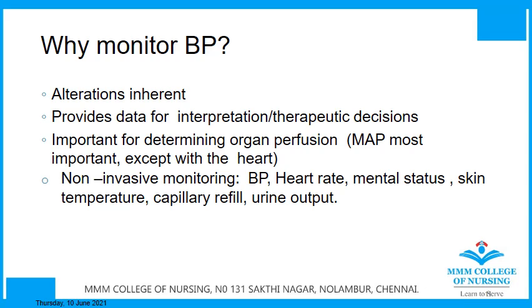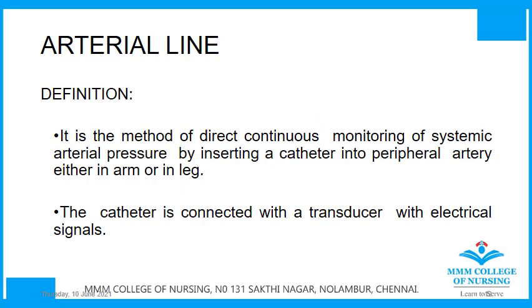Then comes the non-invasive monitoring. Non-invasive monitoring includes blood pressure monitoring, heart rate, mental status of the patient, skin temperature, the capillary refill and the urine output. So let's discuss what is arterial line and why it is used in the ICU setup for a patient.